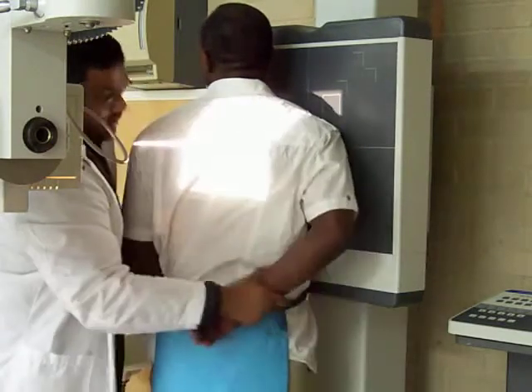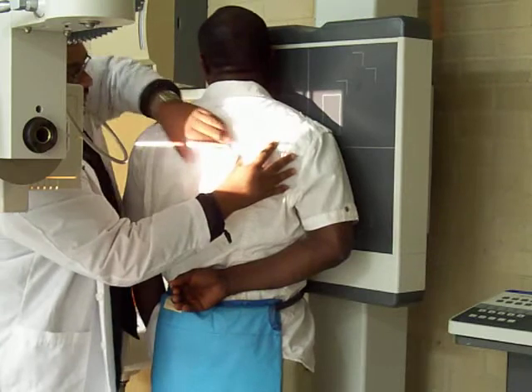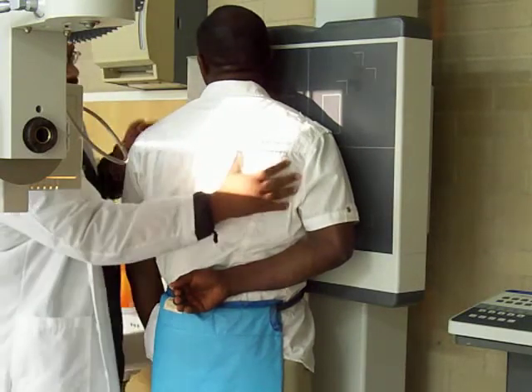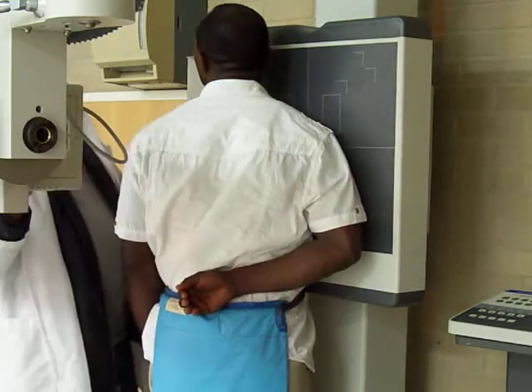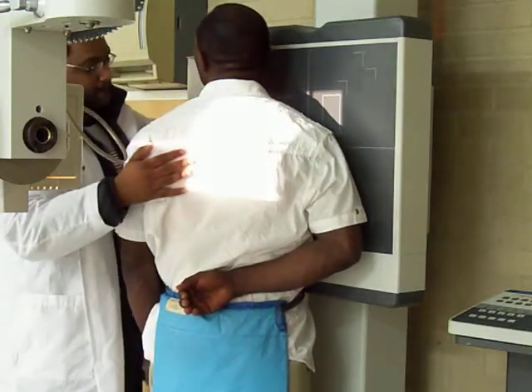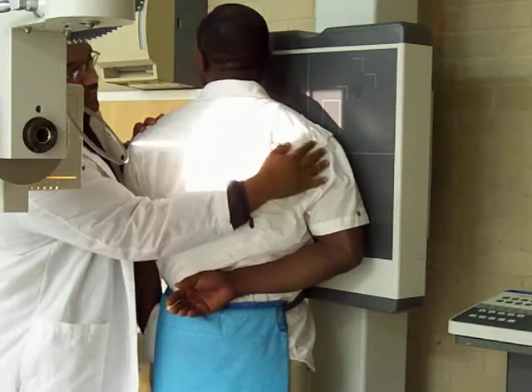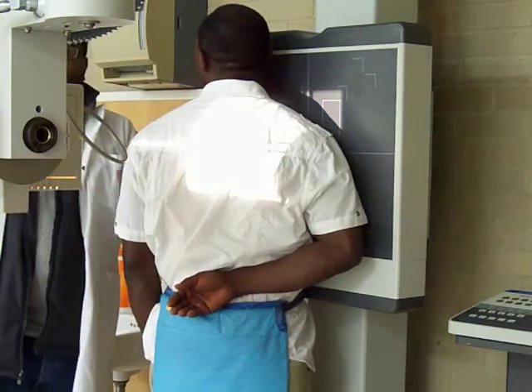Flex the arm. Have them oblique a little bit more. Excellent — this is the Y view of the scapula. Excellent, that's a wrap.